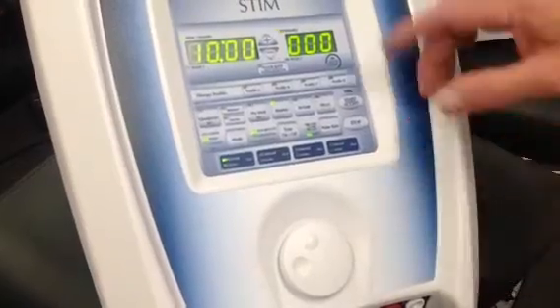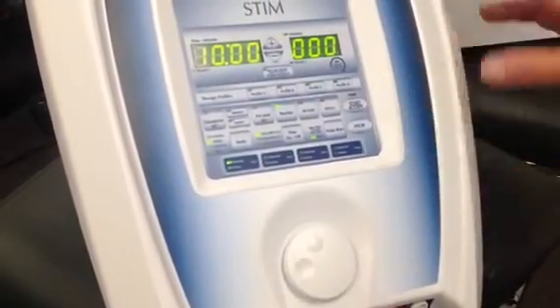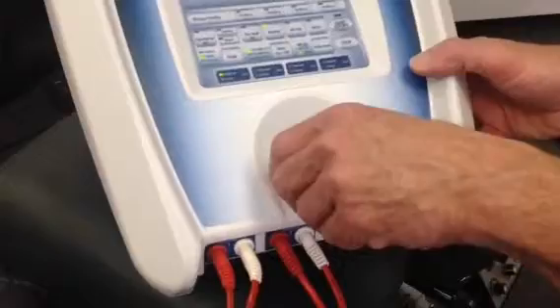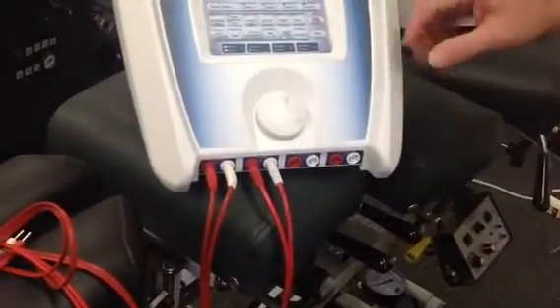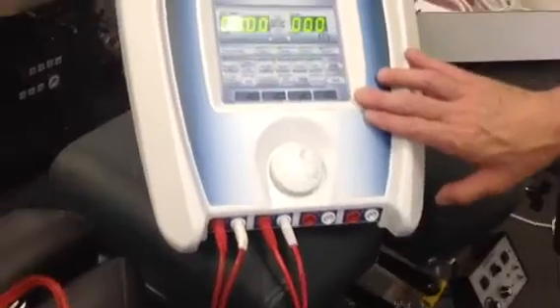All right, so that takes you through the buttons. You understand you have 4 channels. This is your intensity control. And there's your stop button.